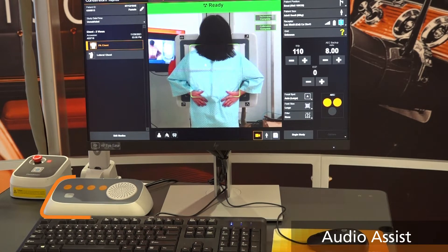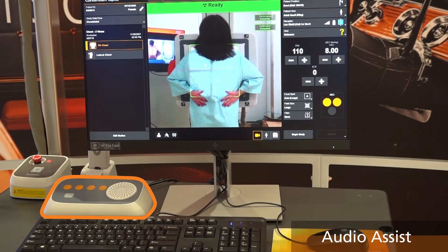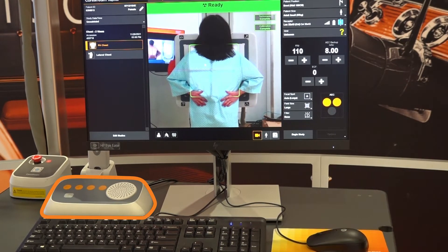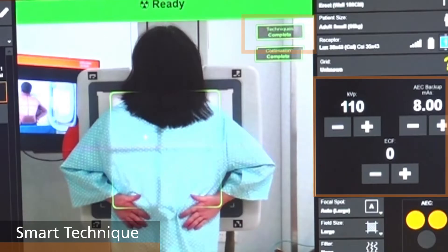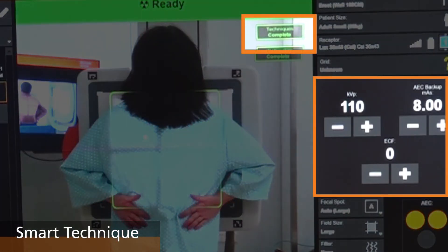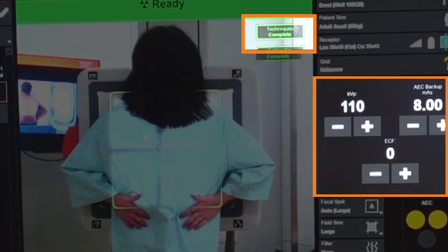AudioAssist helps the radiographer communicate with the patient from the control room by providing direct audio along with a number of pre-recorded audio messages that can be played with the push of a button from a desktop audio controller. Smart technique, as indicated in the corner of the image, uses camera input to automatically set the appropriate technique based upon the detected patient size.